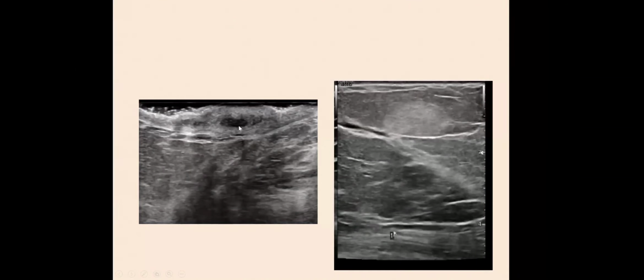See, I put lots of jelly, so I can nicely see. If you do not put jelly, you might have missed this lesion, and you can see it's totally intradermal, with the anterior dermal line and the posterior dermal line intact. So this is an intradermal superficial infected sebaceous cyst. Also, when you put lots of jelly, you might be able to see the punctum in case of a sebaceous cyst. And this is a subcutaneous lesion, which is not contacting the dermal line.